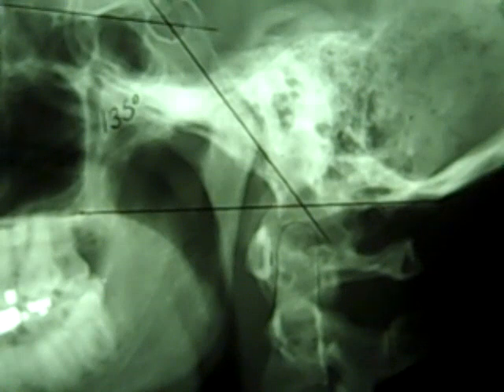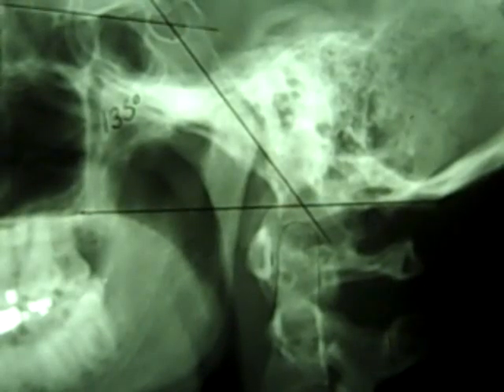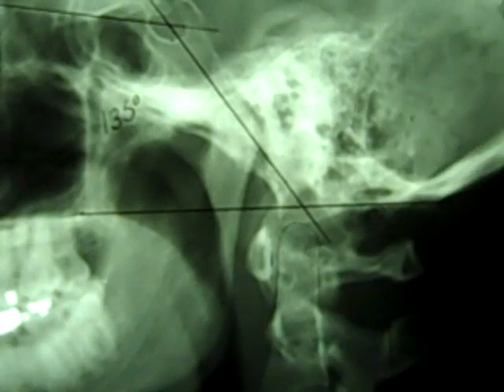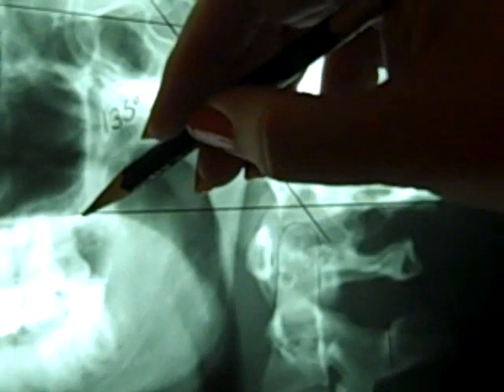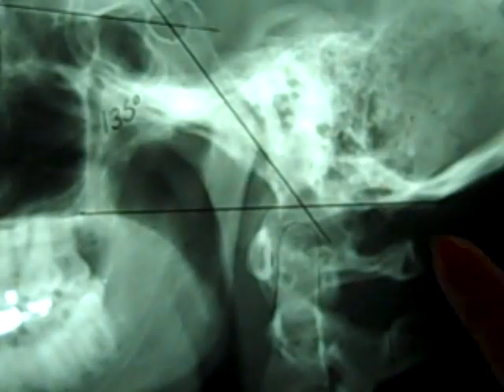The next one on the list is Chamberlain's, and I'm going to actually erase this film of McGregor's, because McGregor's and Chamberlain's look a lot alike. In fact, while I have this still on the film, this point right here versus the other point for Chamberlain's is how I tell them apart, because when you're in a testing situation, this dot plus the dot for Chamberlain's in this area looks identical. And so I tell my students, look back here to decide which one you are looking at.